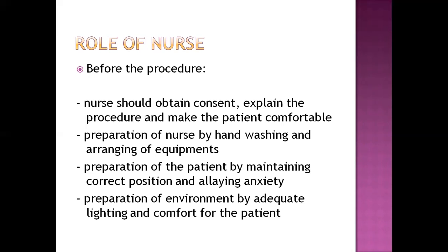Next is preparation of patient. Preparation of patient should be done by maintaining correct position for the procedure and allaying anxiety of the patient, communicating to remove the anxiety of the patient. Next is preparation of environment. Environment is the place where the procedure is going to be performed. Preparation of environment can be done by placing adequate light and providing comfort to the patient.